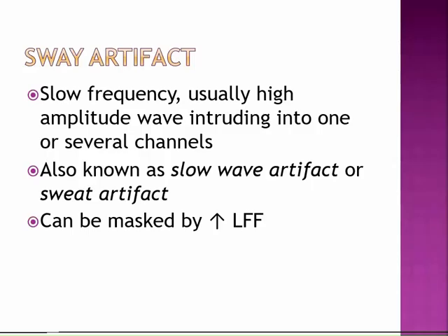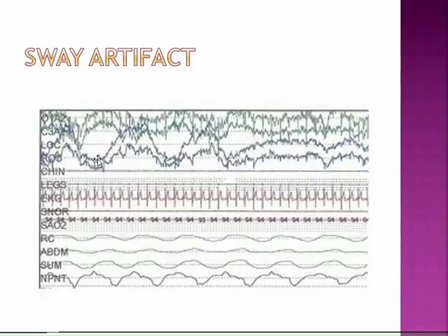The low frequency filter is a filter that's applied that will block any of the lower or slower frequencies from coming through. By raising it temporarily, slightly, you can block this slow wave bounce coming through. And I say temporarily raise it because you don't want to increase it for the rest of the study. Typically, patients might sweat a little bit and then their body self-regulates and you're fine. Especially if you have a female that is having a hot flash, it'll go away. You just gotta wait it out.